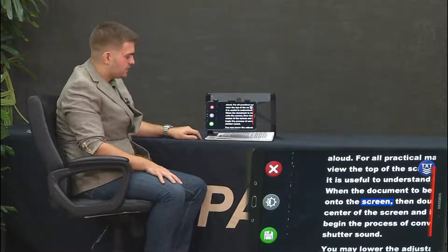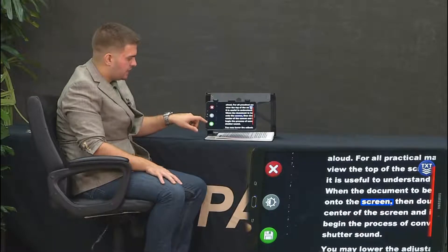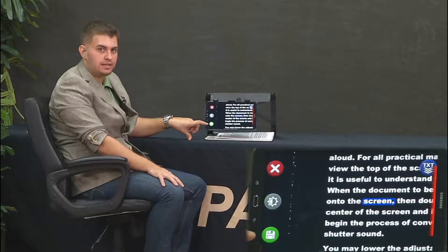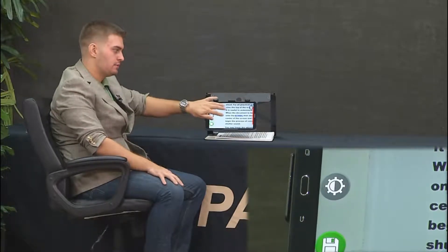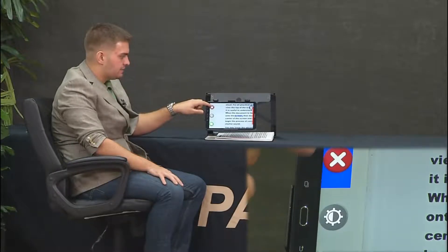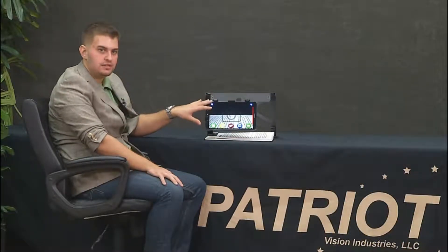I'm going to go over some of the icons along the left. The bottom left one is to save documents so you can pull them up at a later time. The second icon is to go back to original color mode, and from there the color mode cycling process restarts by tapping with three fingers. The last icon is the X — pressing that gets you back out of reading the document you took a picture of.